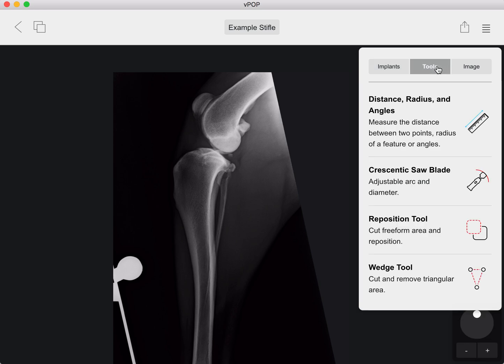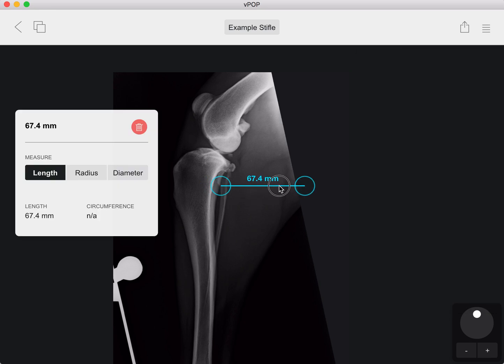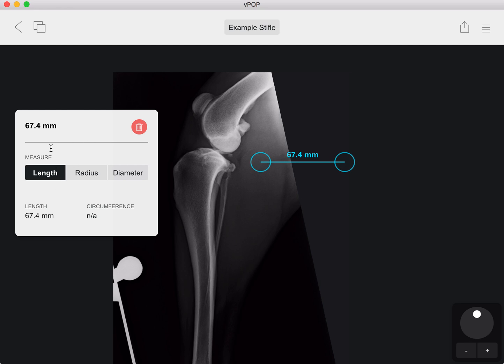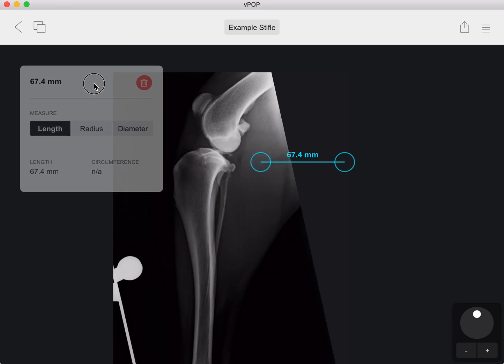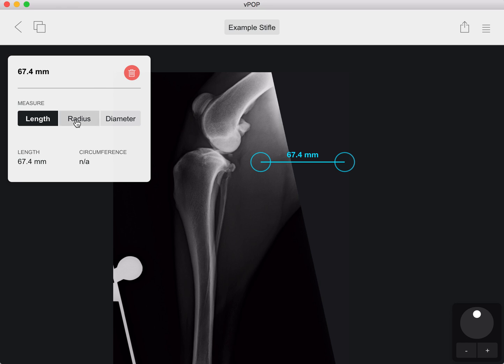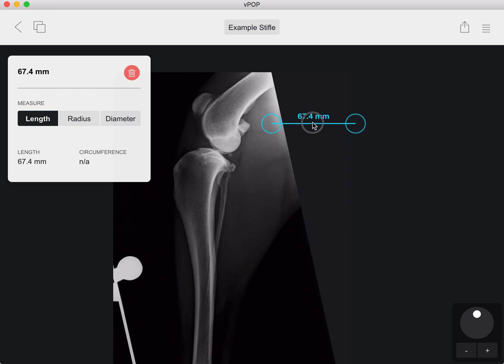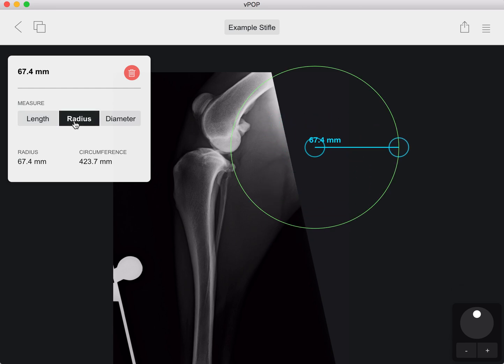If we go to tools and we want to measure a distance, a radius, or angles, it's the first section here. Click on it and up comes our line. On our smart palette, which we can move around wherever is convenient, we can either go to set length or we can go to radius or diameter.